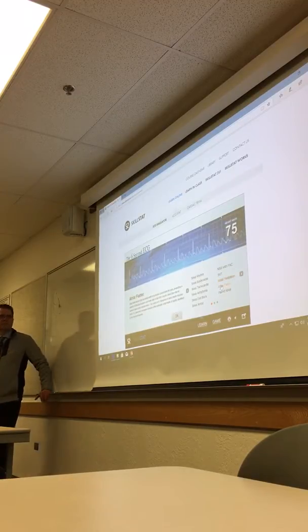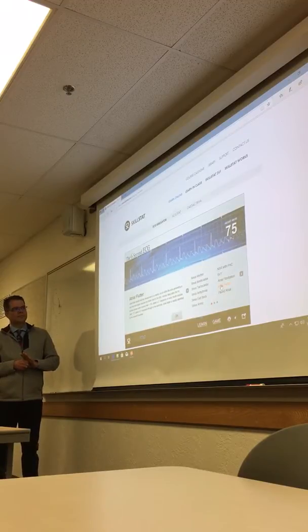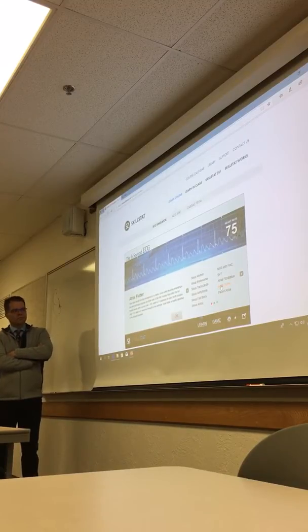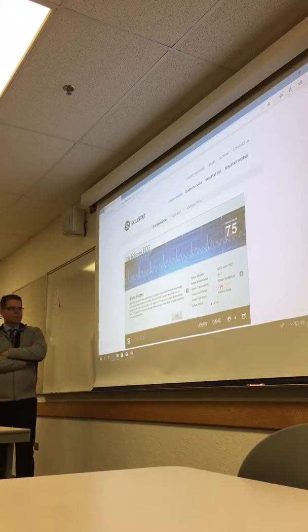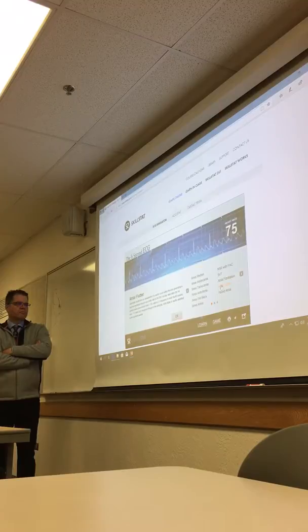So atrial flutter is the same as atrial fib, except it's cyclic. It's just going on a straight rhythm. So it always has that sawtooth pattern. So spend some time going over and looking at the monitor. We had 2 patients in perfect atrial flutter on Tuesday on the 4th floor. And it's not all that common to see, so. Is one more dangerous than the other?